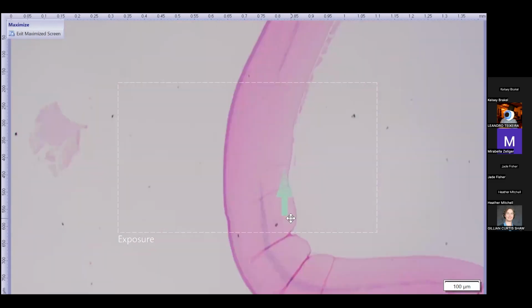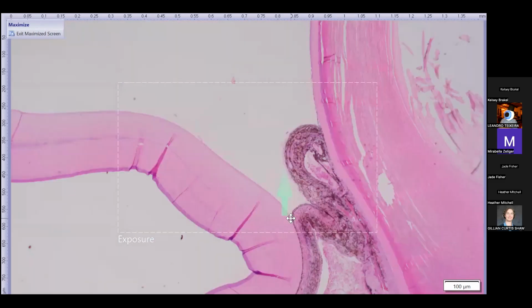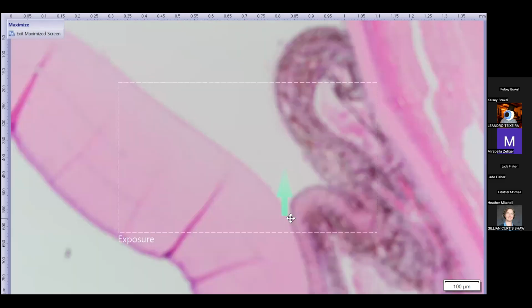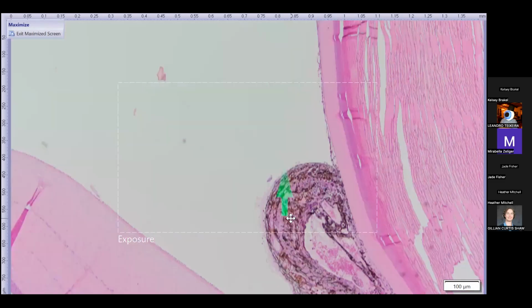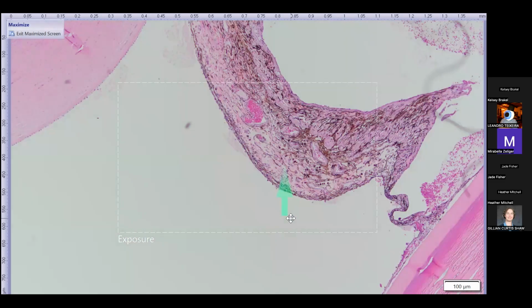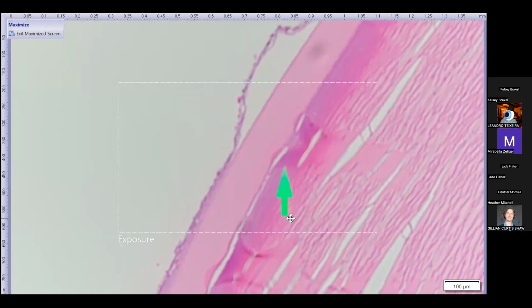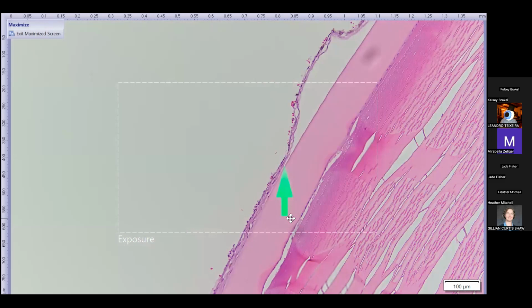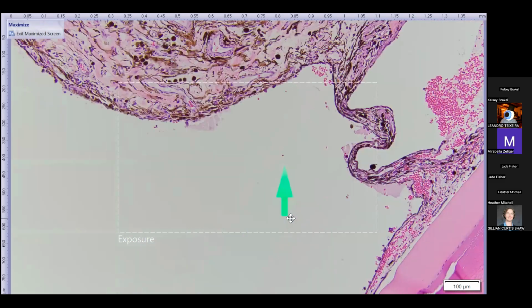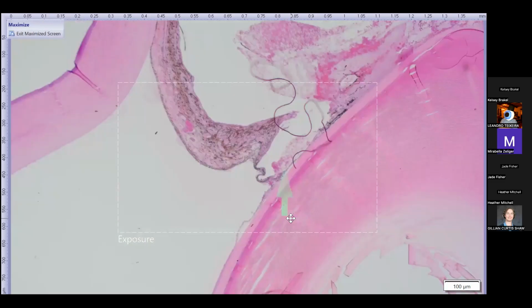So as I said, front of the eye, pretty boring actually. So here's that corneal stromal vascularization. When we look at slightly higher mag at the iris and its relationship to the lens, over here, there is a pre-iridal fibrovascular membrane that's not as obvious in this case as it was in the other case, but it also continues across the anterior lens capsule as a pupillary membrane, which is what the arrow is pointing at right there. And then we have really convincing synechiation of the iris leaflet to the lens capsule and the billowing forward, as I said.